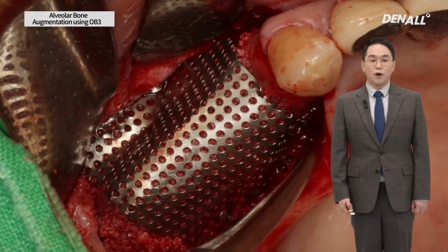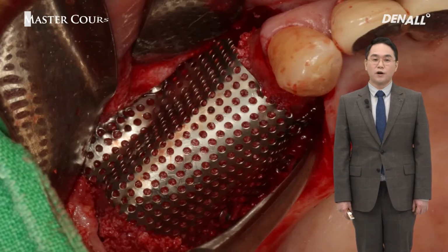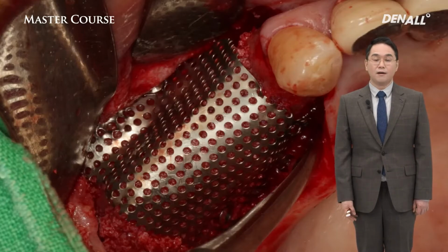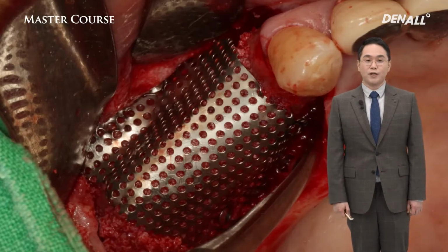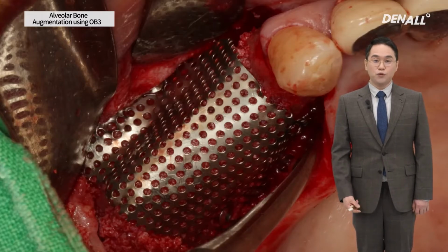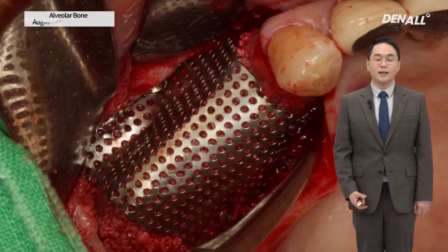And then the graft materials are covered with the titanium mesh. On the palatal side, it is fixed with the bone screws. The standard titanium mesh is different from general membrane as it has poor adaptation capability. As titanium mesh is metal, if it is not fixed, things below it will move. So the bone graft material would be exposed or will be unfavorable for bone regeneration. So what is important for titanium mesh is stable fixation. So standard titanium mesh would be fixed with the bone screws.